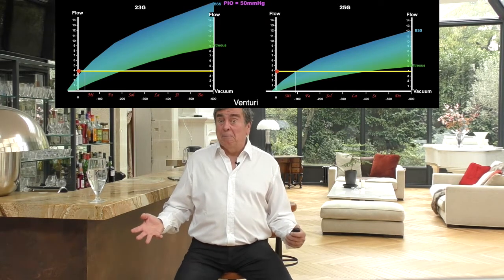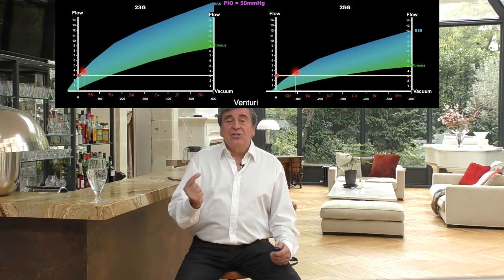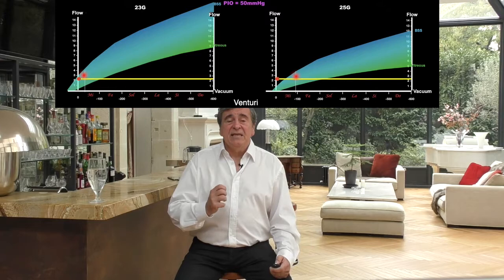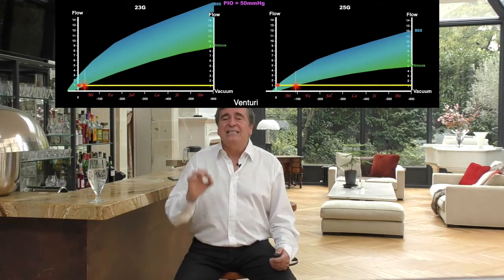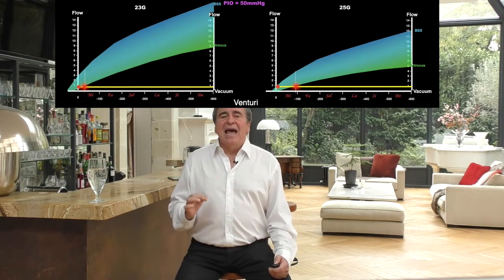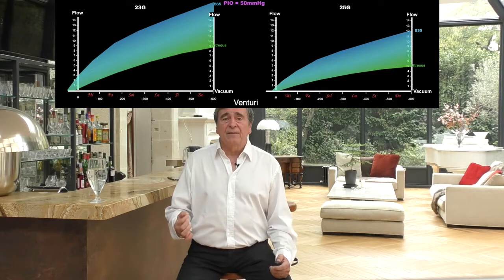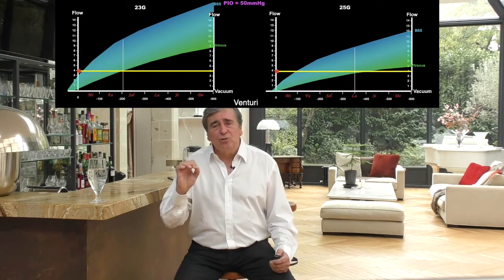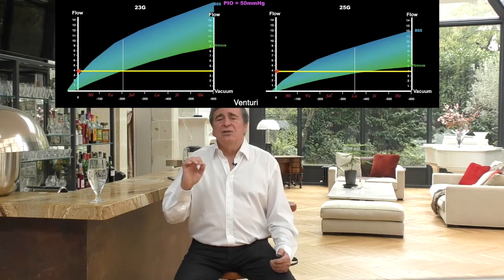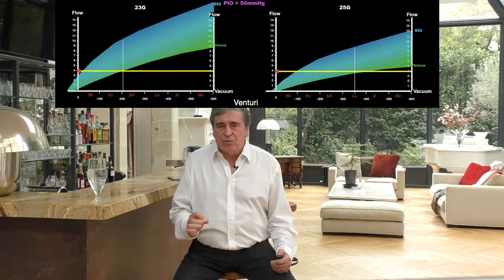Why not? Because once he has drawn the vitreous into his handpiece, the friction will bring the flow rate down to less than 1 cc per minute, and he will find that it is not efficient enough. He will then choose a vacuum of minus 200 or minus 250 to have an acceptable flow in the vitreous.